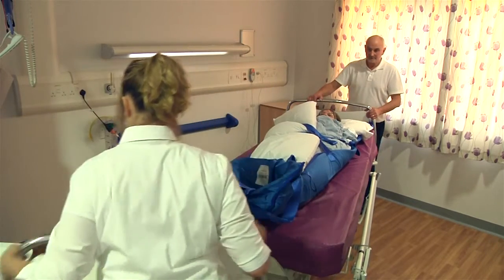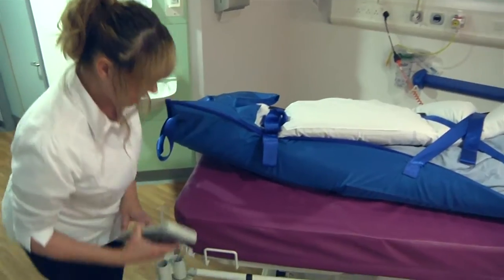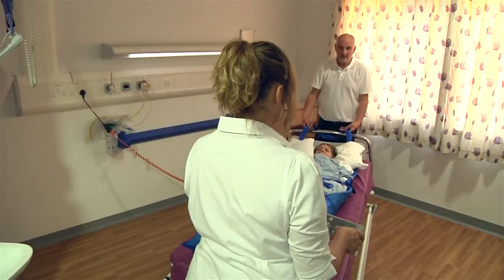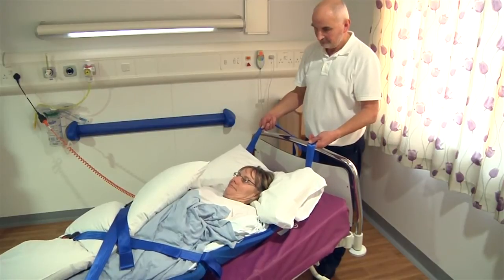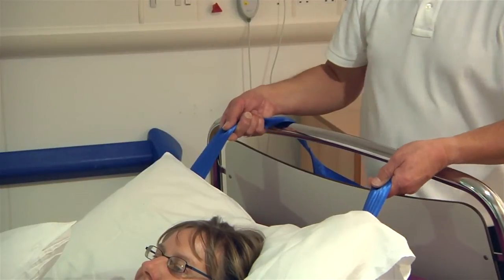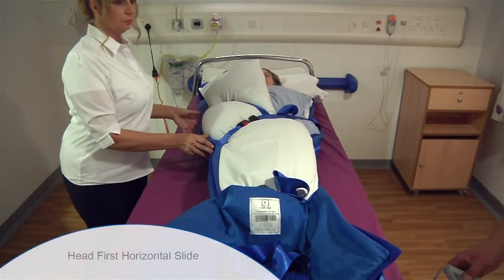Remove the foot end of the bed, then lower and tilt the bed. The patient is then pulled off the foot end of the bed. Make sure to protect their head throughout this procedure, particularly as the head comes off the end of the bed. Lower the bed down to its lowest position.